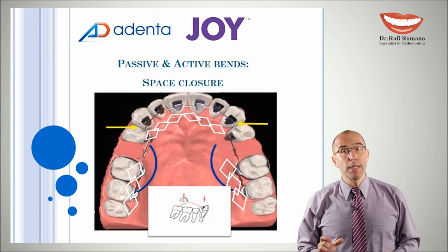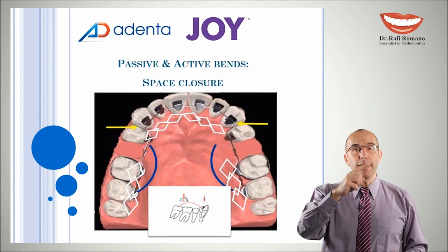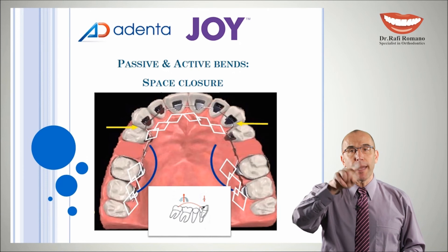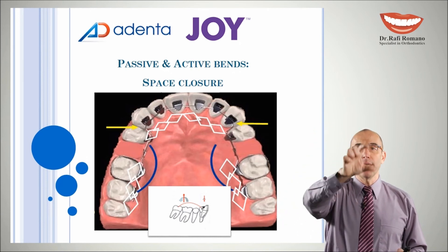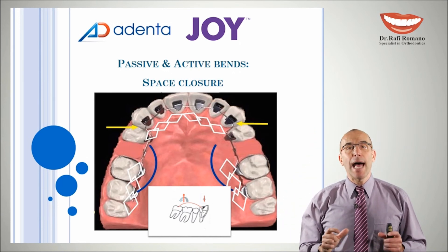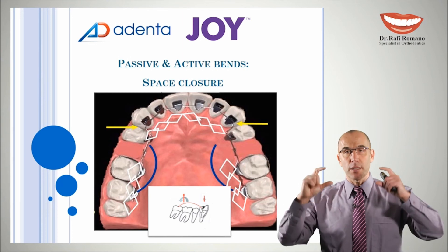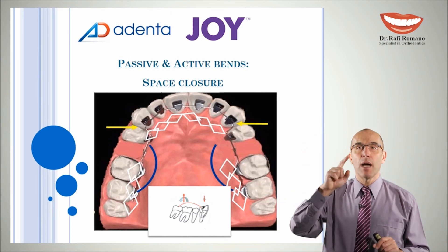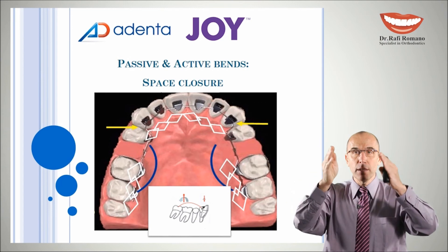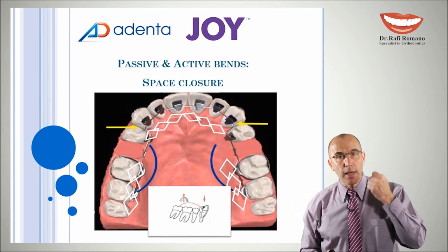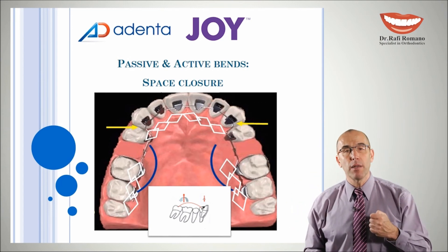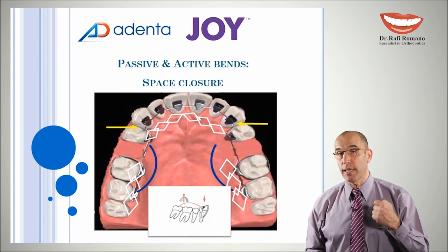How we stabilize the segments? We take metal ligature and we create figure 8 around all these 3 segments. After we have done all these 3 segments, we are doing the wire which is usually a rectangular stiff wire like 16 by 22 stainless steel.